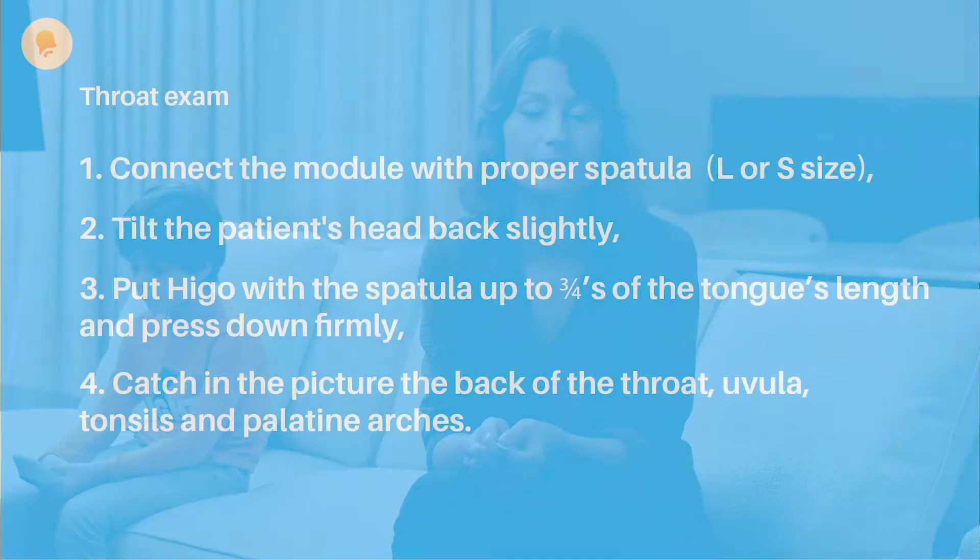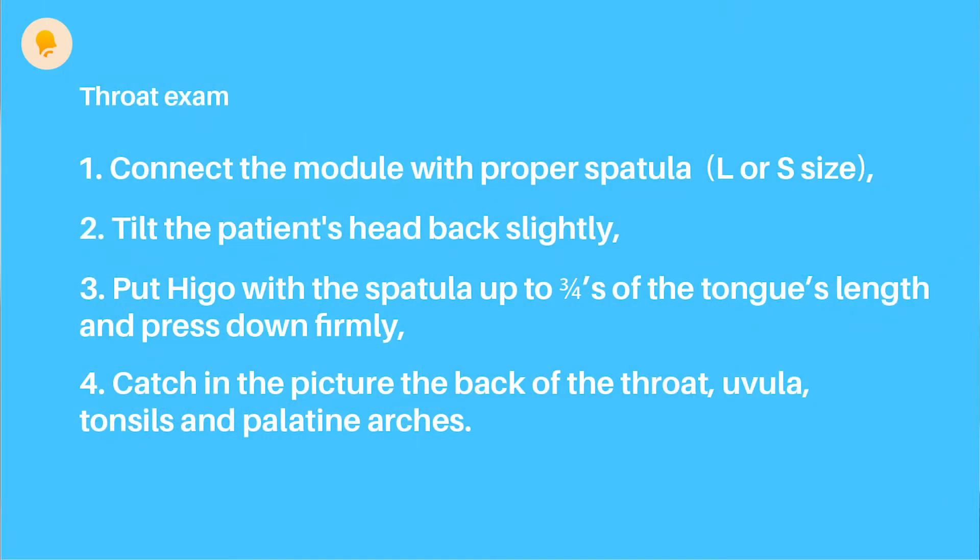Keep in mind the three most important elements of the throat exam: tilt the patient's head back slightly; insert the device with a spatula up to 3 fourths of the tongue's length and press down firmly. If you can see the back of the throat, uvula, and palatine arches, you can finish the exam.